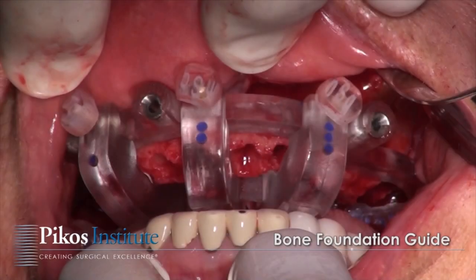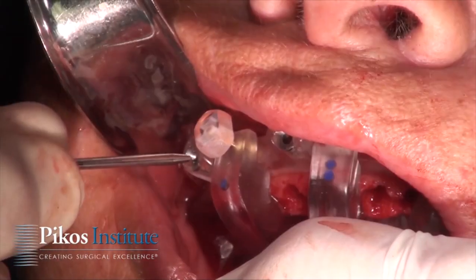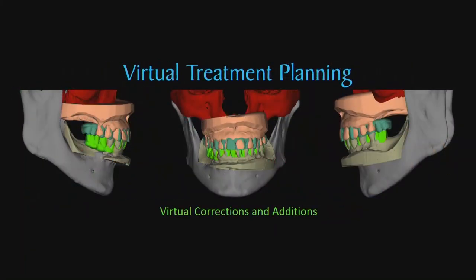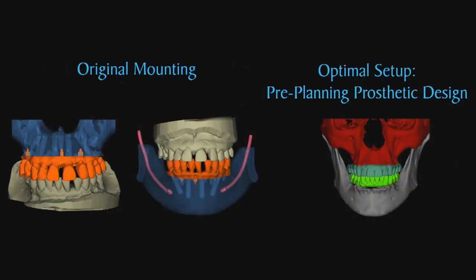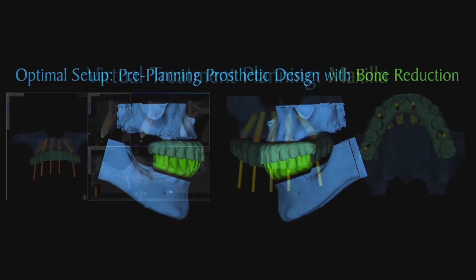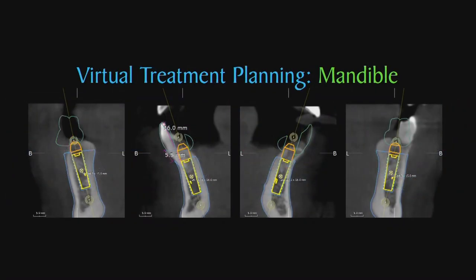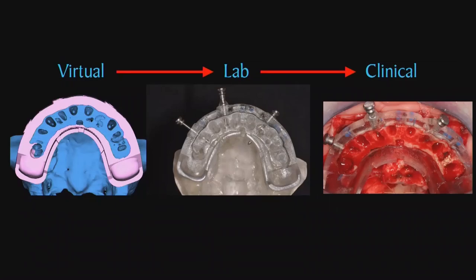What we share with you are some basic principles and concepts with regard to a protocol that is fully guided, full arch reconstruction, not just guided for surgery, i.e. implant placement, but also for placement of a prefabricated PMMA monolithic bar-supported prosthesis, a fixed hybrid prosthesis. So this is very unique, and it's compared to basically our conversion protocol that we all follow and do for X number of our cases.